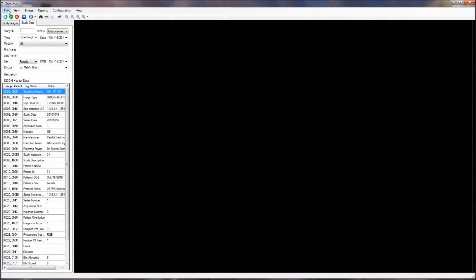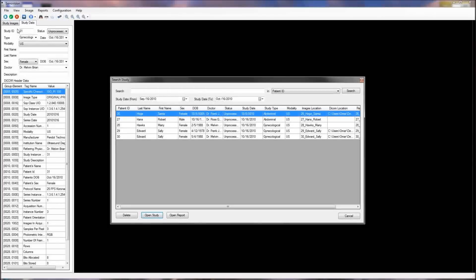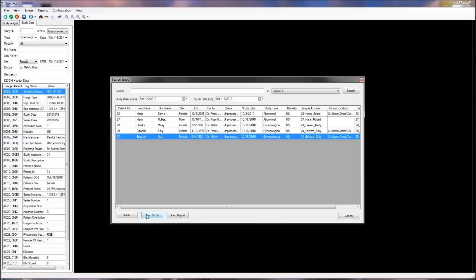As mentioned earlier, all studies, images, and examination records can be saved in the local database or DICOM server, so you can also reload the study for further processing or reporting.